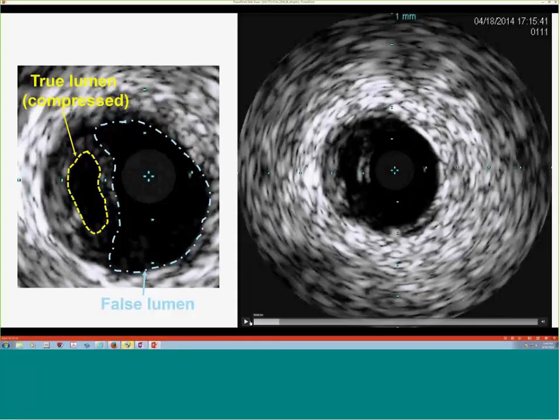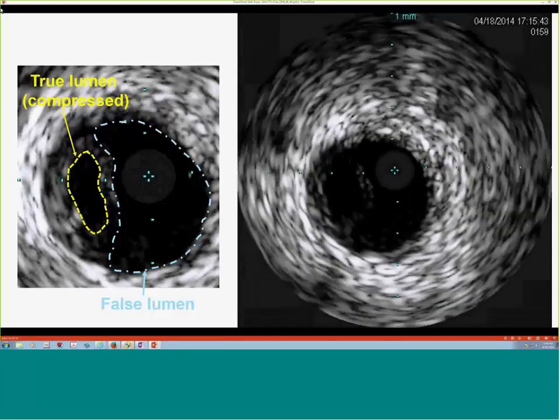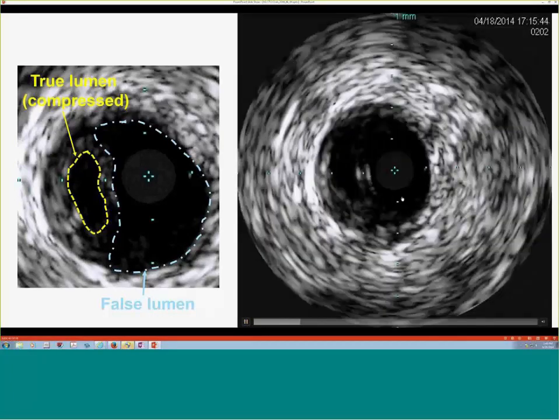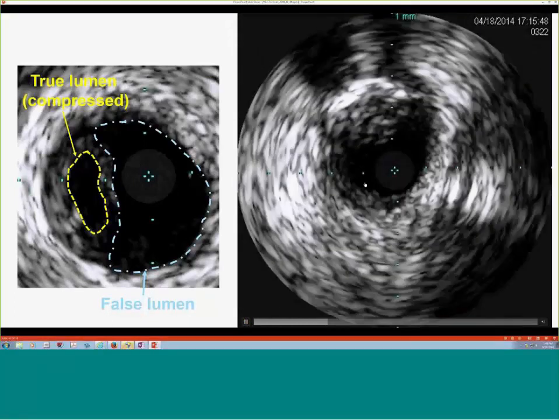Good. That's a good tip. It's not always easy, as exactly you said. I mean, in this case, you can almost see the vessel here. Again, here it's a little different. It's much more clean because I think this vessel doesn't have much calcium. That's what helps us make good pictures. But otherwise, again, if I see this nice, smooth, dark area, it makes me concerned.